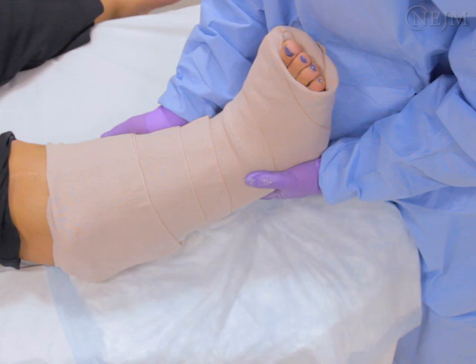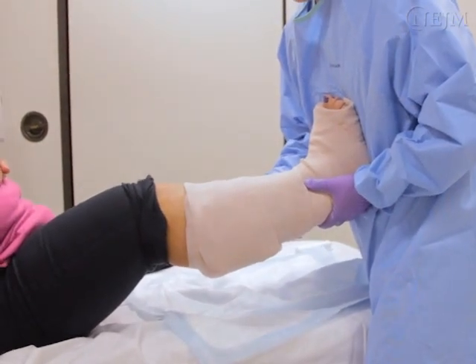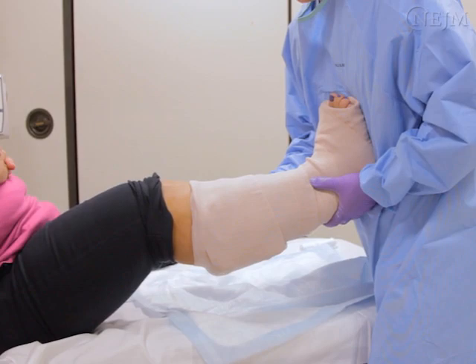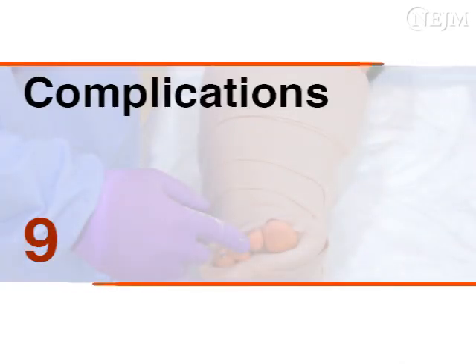To avoid the creation of undue pressure points on the underlying skin, apply pressure with the palms of your hands rather than your fingers. Take particular care when treating elderly patients in whom pressure points can lead to major skin ulcerations. Hold the mold in place while the splinting material hardens. This process may take 5 to 10 minutes.